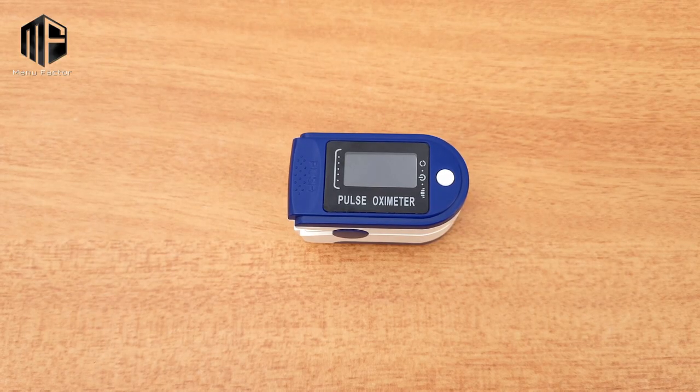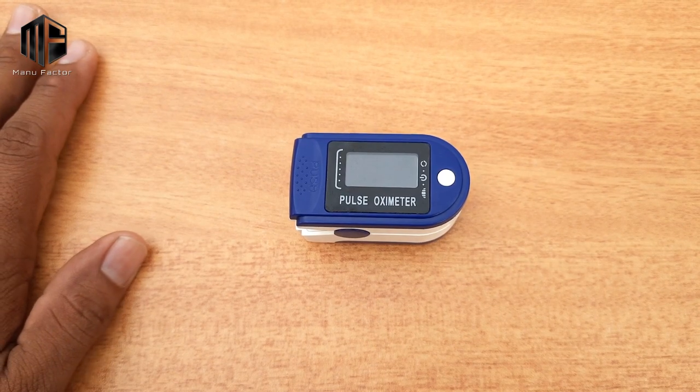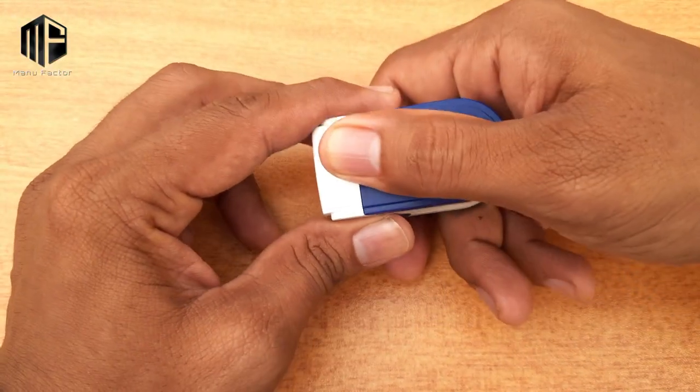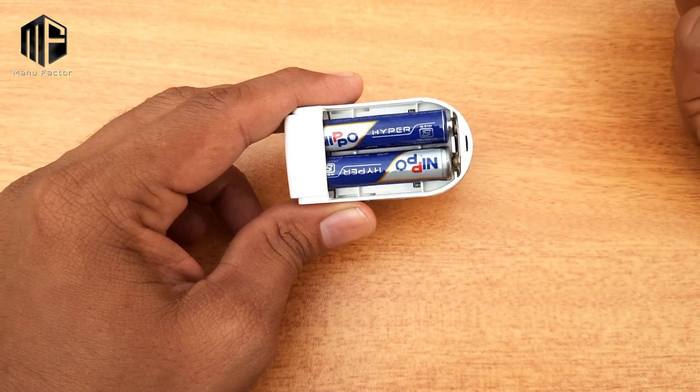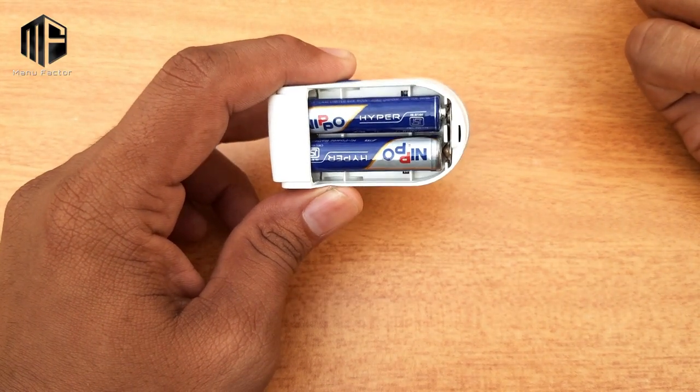In this video, this is our pulse oximeter device. I will tell you about this device. This is a battery-operated device. There is a battery insert and we can use triple-A batteries.